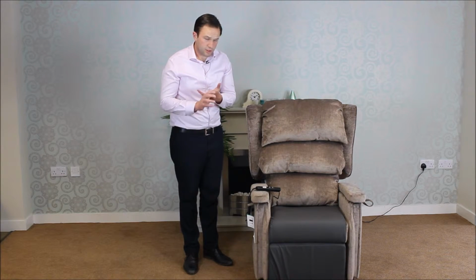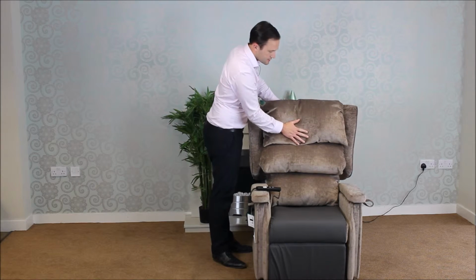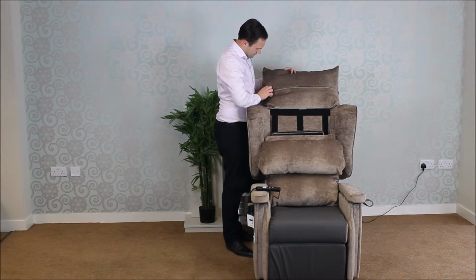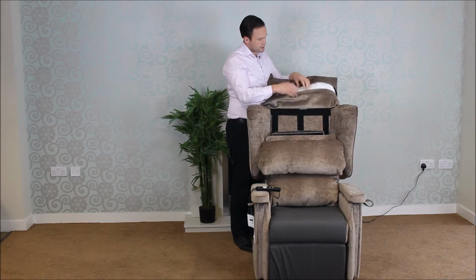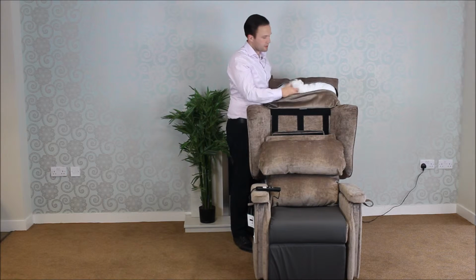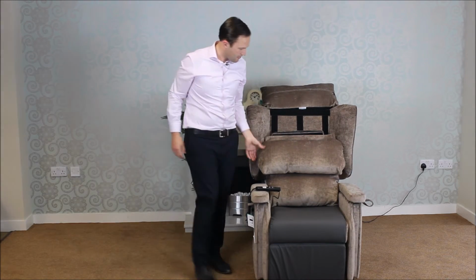The next thing is posture. There are different postural support options that you can try with the chair, and these may well have an impact on comfort. The most popular backrest we find is the waterfall backrest, and you can be creative in terms of removing stuffing and changing the way the waterfall backrest works. So to remove stuffing, undo the zip, make a cut in the bag with your fingers, and just take the stuffing out. By doing this, you can accommodate different posture requirements, for example a kyphosis.